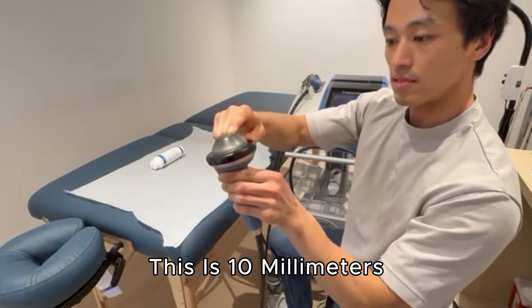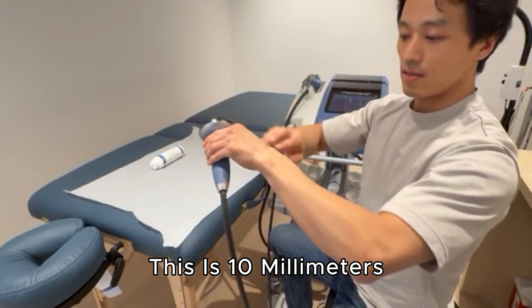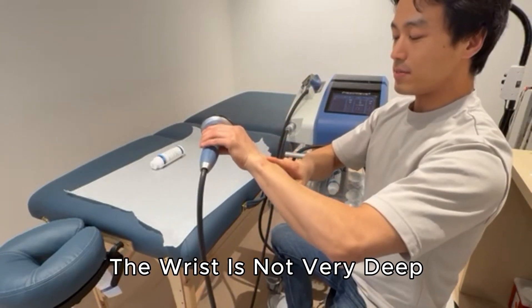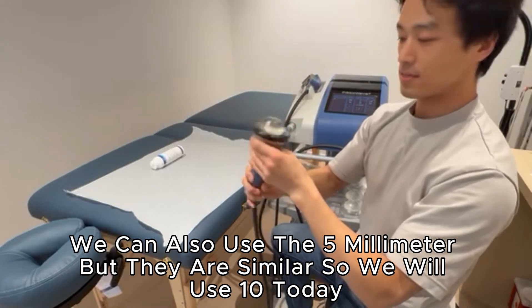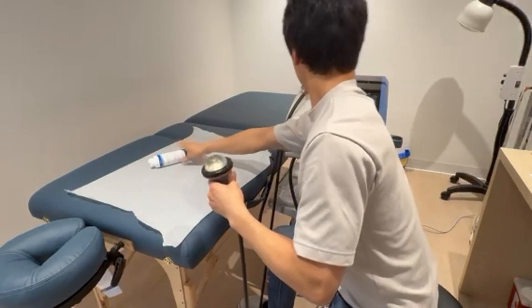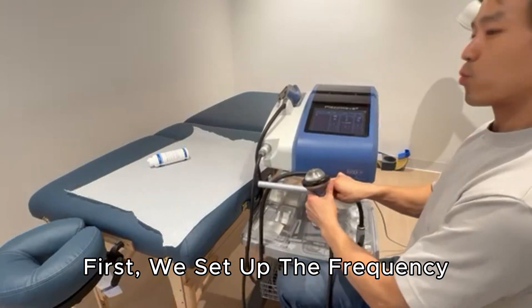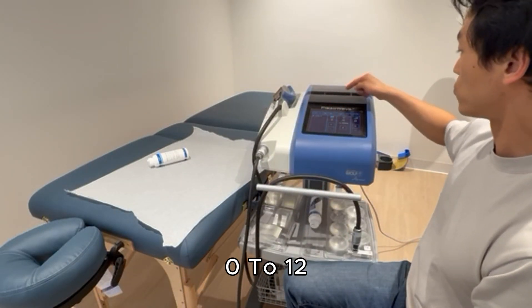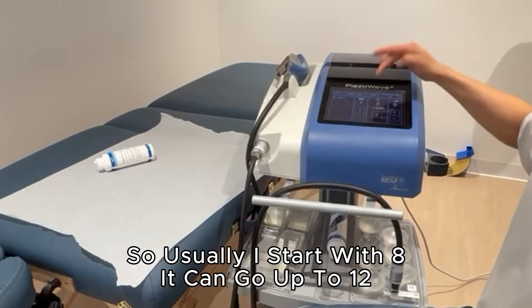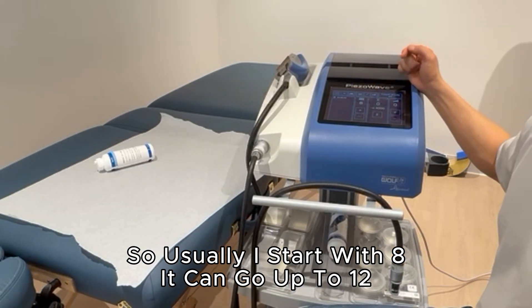I'm going to use the smaller pad. There is a number here — this is 10mm. The wrist is not very deep, so I'll use 10mm. I could use 5mm too, but they work similarly. On the screen I can set the frequency from 0 to 12; I usually start with 8 and go up to 12.